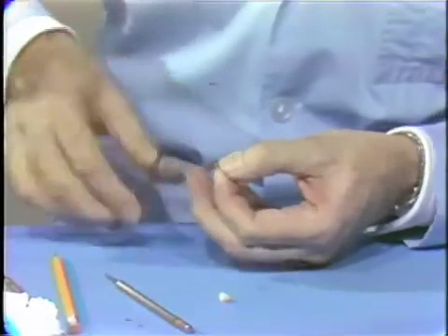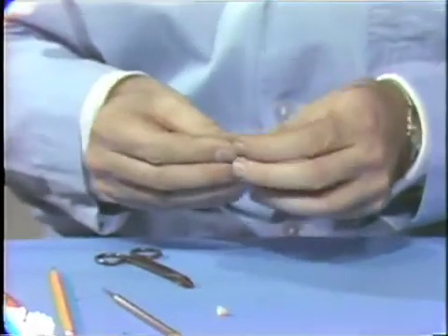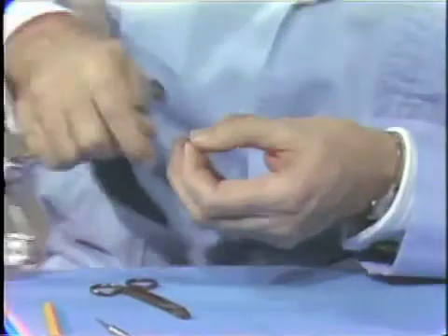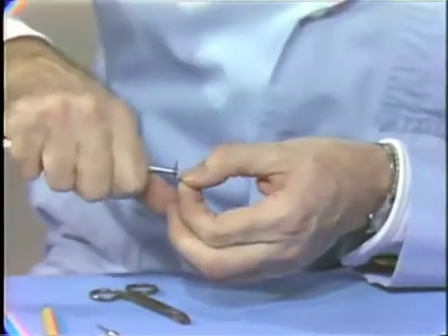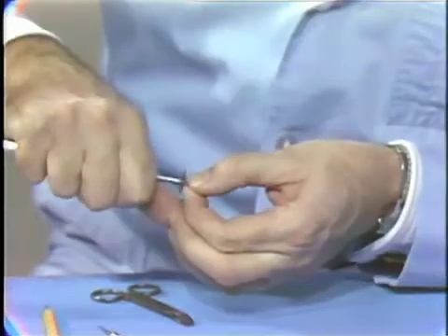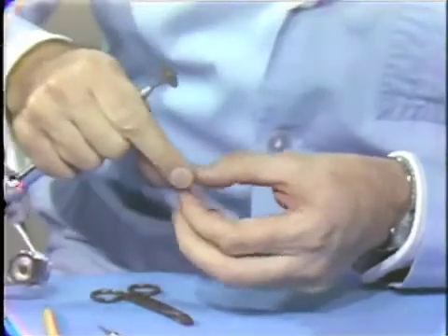Now, you will not get a precise cutting of the backing using the shears, and it's necessary to take either a carborundum stone or a Joe Dandy disc and complete the contouring with that.